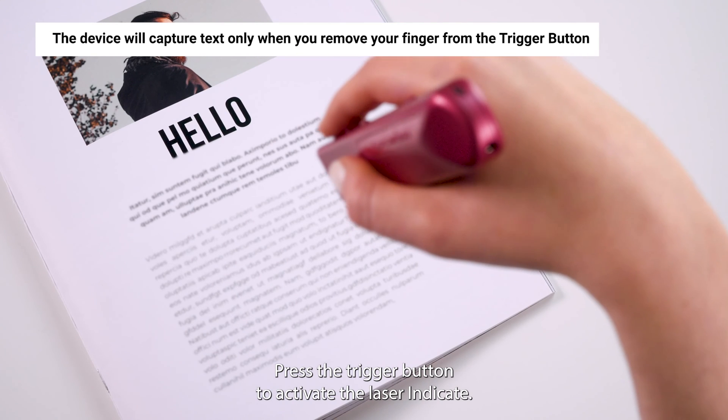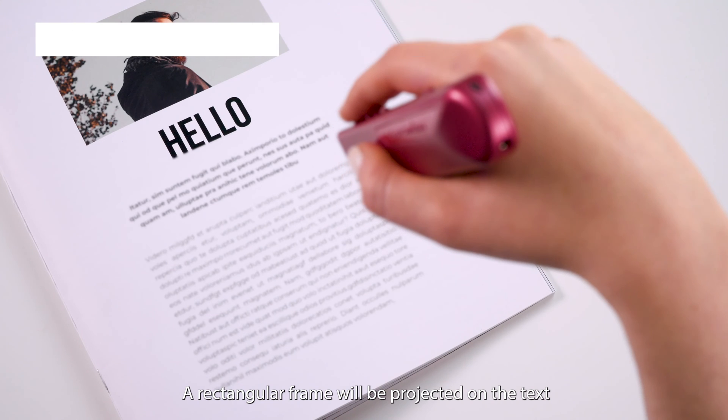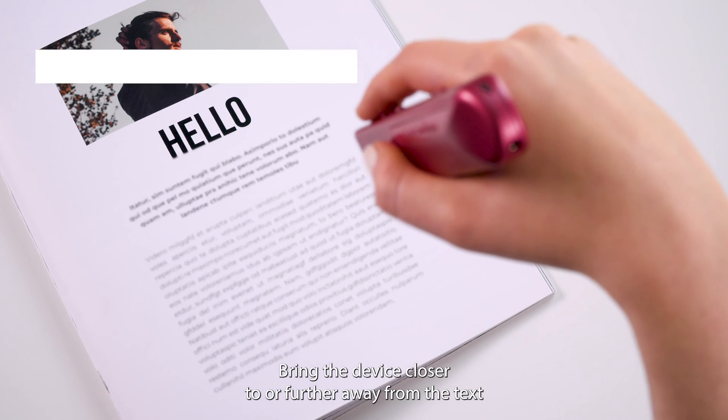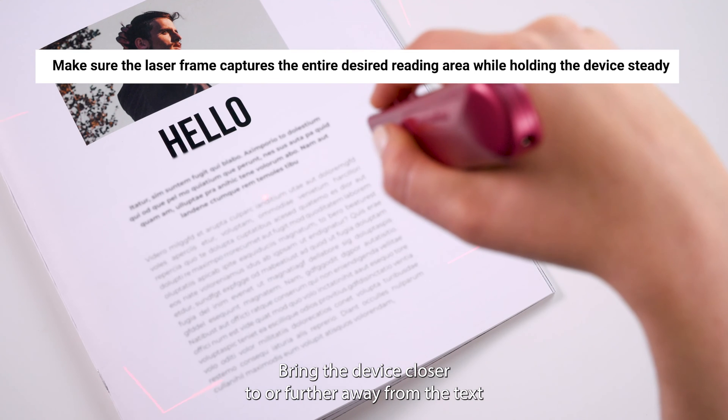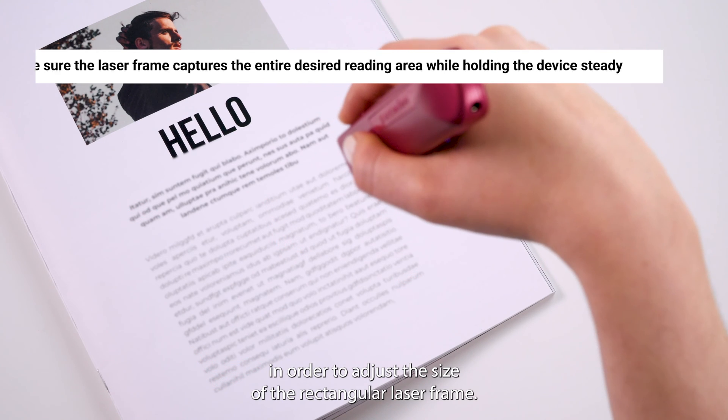Press the trigger button to activate the laser indicator. A rectangular frame will be projected on the text. To capture the desired text, bring the device closer to, or further away from, the text in order to adjust the size of the rectangular laser frame.